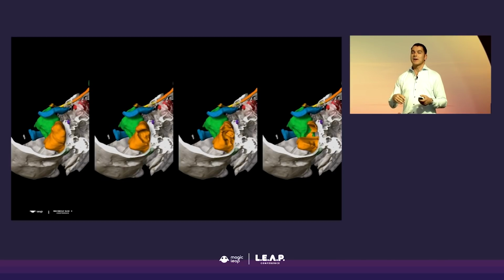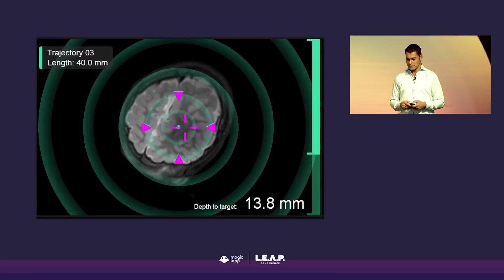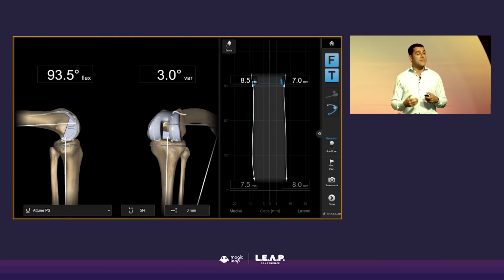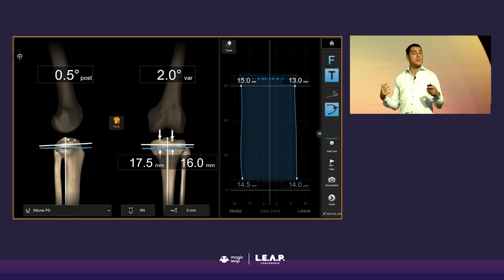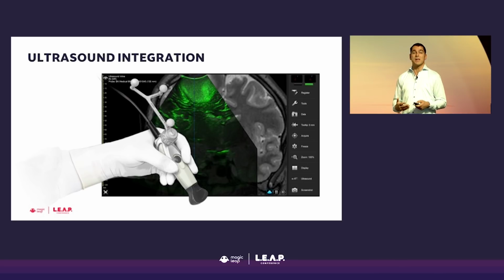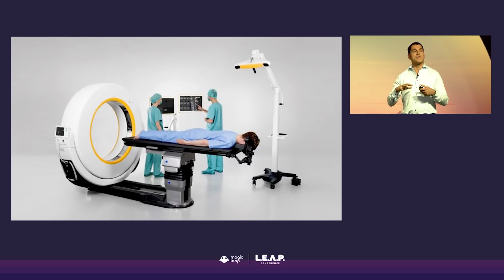And we can also navigate a perfect cut and use it for placing an implant in the perfect position in the spine, in the hip, or also the knee. Then there's a number of different other sources in the operating room we want to digitize, such as ultrasound. If navigated and digitally integrated, it provides us orientation and also update of soft tissue. An intraoperative CT scanner is another ability to update tissue in the middle of an operation. And with all those precise spatial sets of information, we're able to use that to also guide a robotic arm to make a perfect alignment to a predefined trajectory.